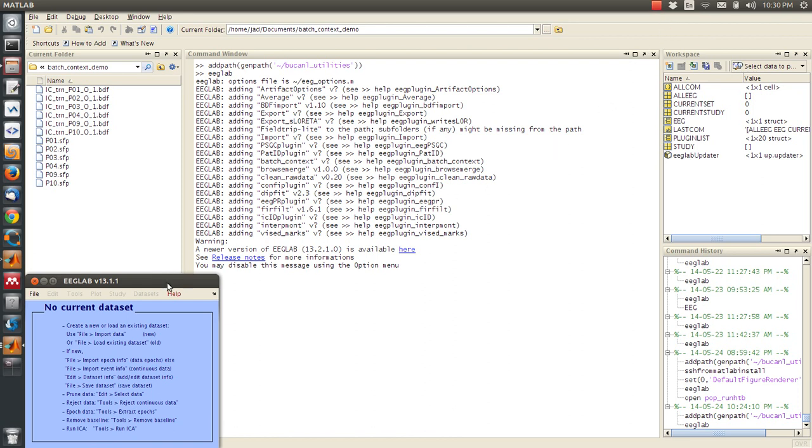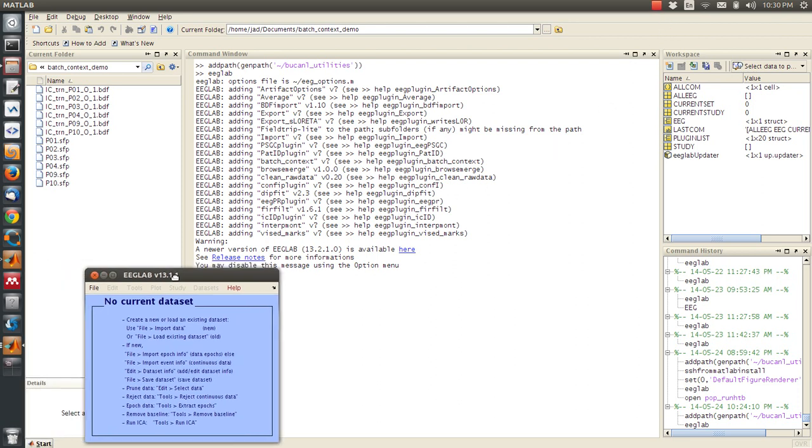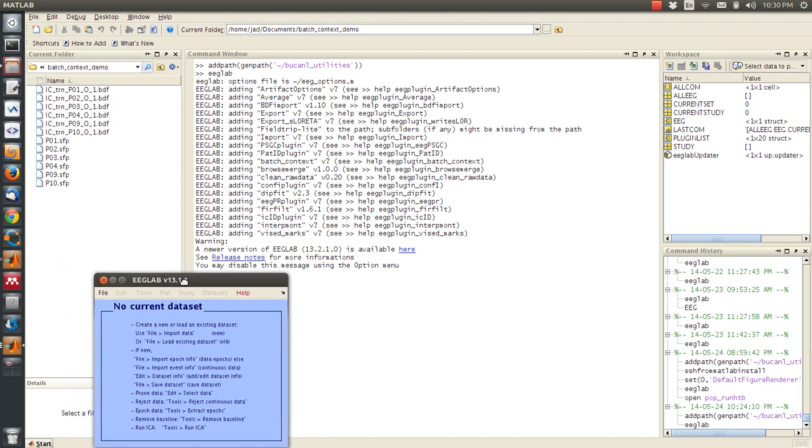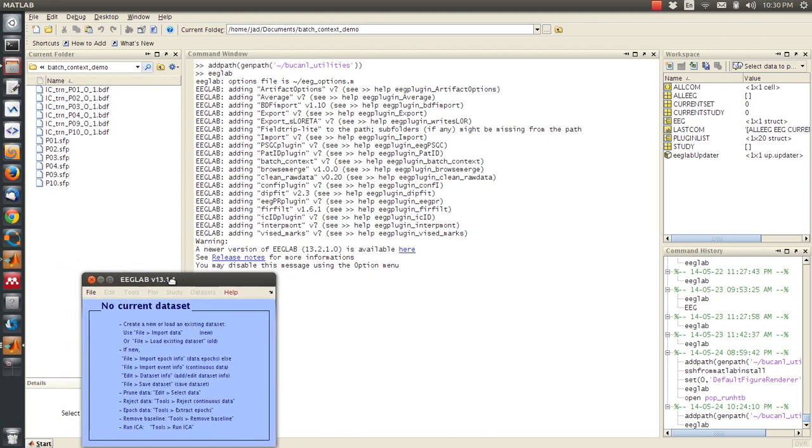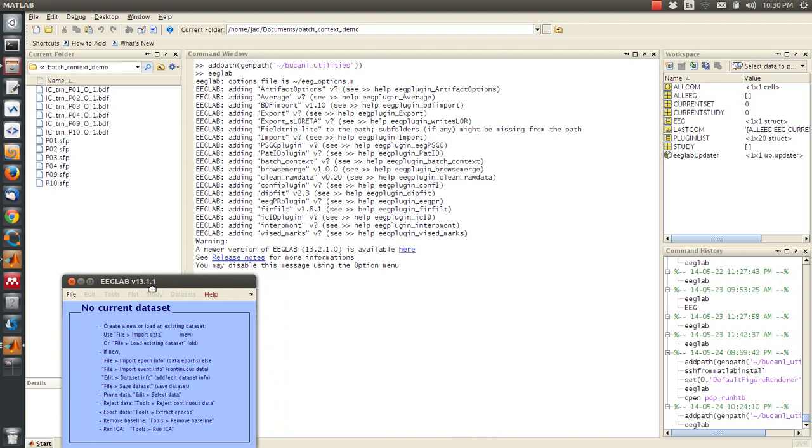This is a quick demo of the batch context plugin being used to generate small scripts and then execute that small script on several data files from the EEGLAB graphical user interface on the local computer. This example is going to load a raw data file, then read in the coordinate file, and then save the combined EEG data set to a new file, renaming it.